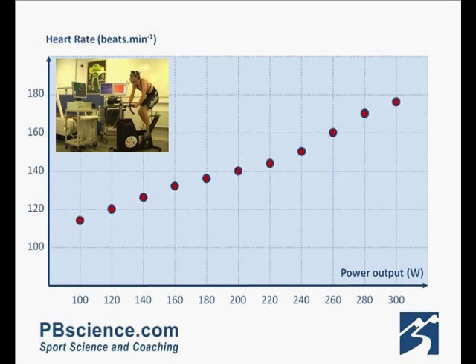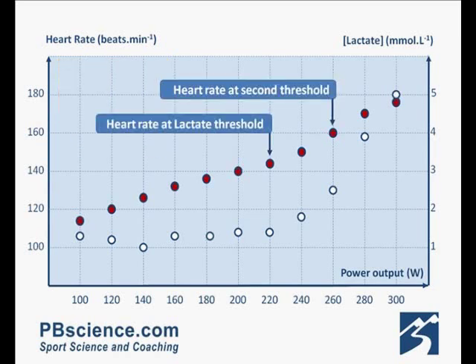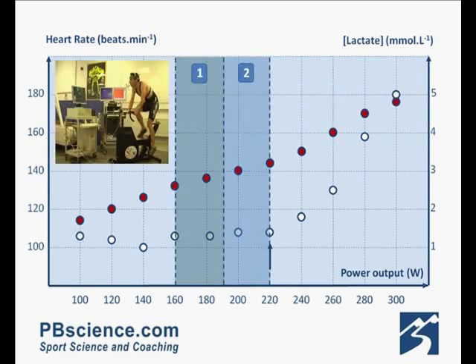Here's a chance to look at our heart rates during the stages too. And as you can see, there's a nice linear function of heart rate against power. If we add the blood lactate response in on top now, it's quite easy to see how we can use this information to guide our training. If we put here our heart rates at lactate threshold and also our heart rate at the second threshold, we can now begin to guide our training zones.